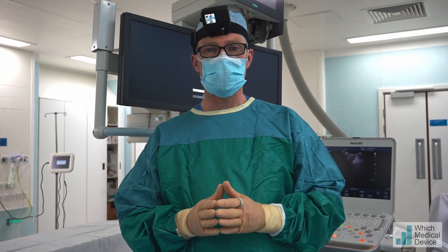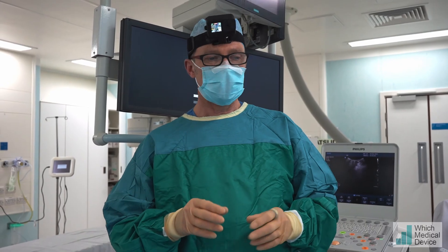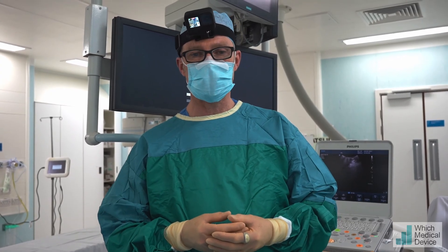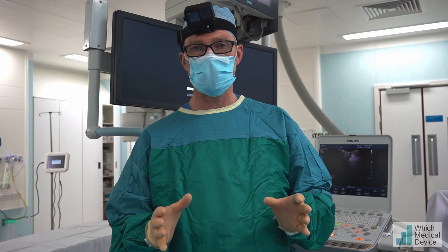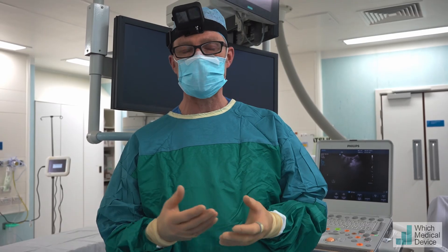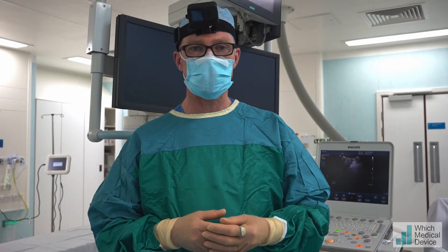What we're going to do today is place a Pleurex drain, which is a long-term drain used for draining ascites. This is a patient with malignant ascites who's had frequent percutaneous drainages before, which means hospital admission on each occasion. Placing a Pleurex drain — a very quick and straightforward procedure, a bit like placing a Hickman line — will allow her to have drainages performed at home without having to be admitted to hospital.